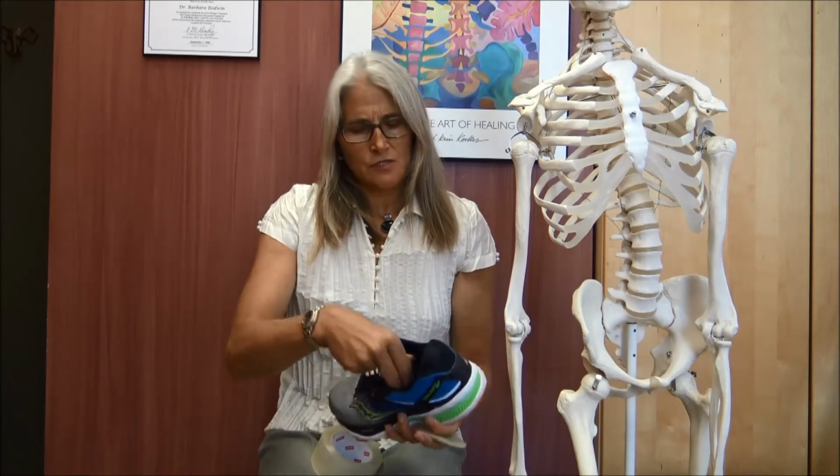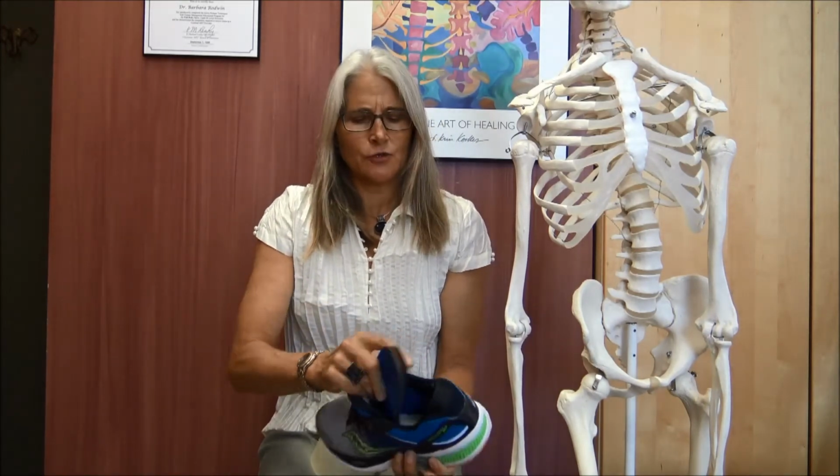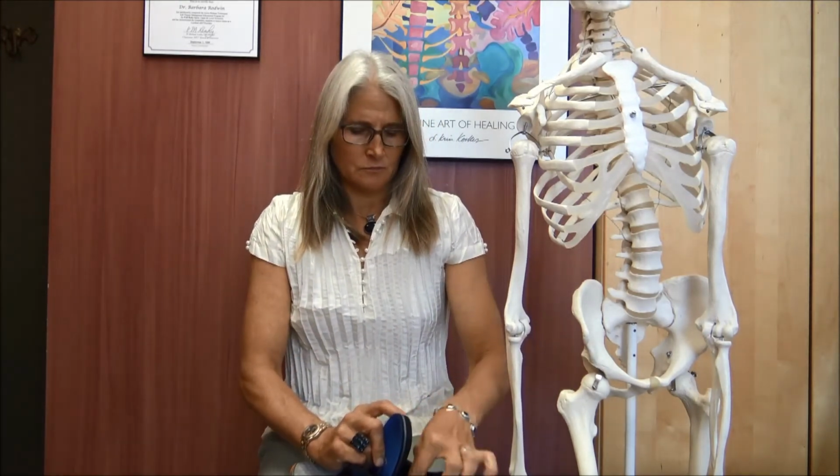I am now going to explain how to get it into different footwear. With respect to the heel lift, if you are putting it into footwear where the insole pulls up, so if you do have orthotics and the insole pulls up, just place it underneath and push it to the back.